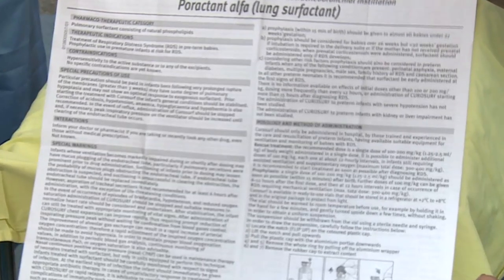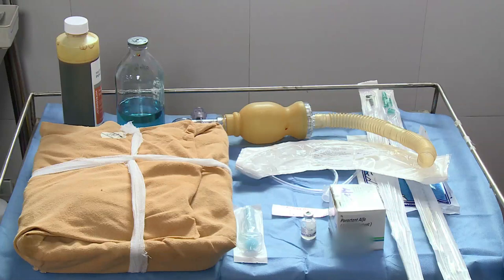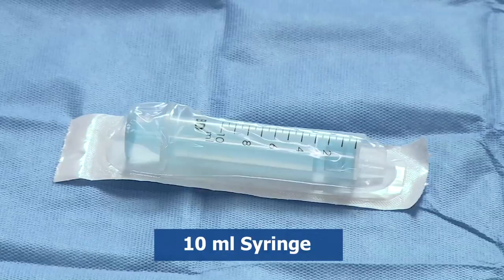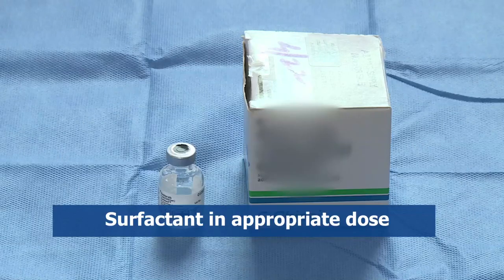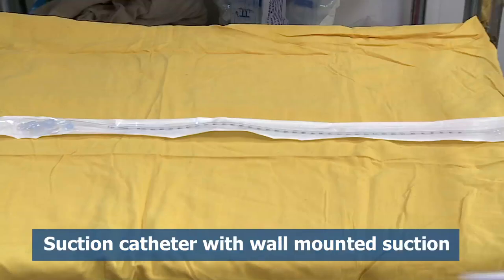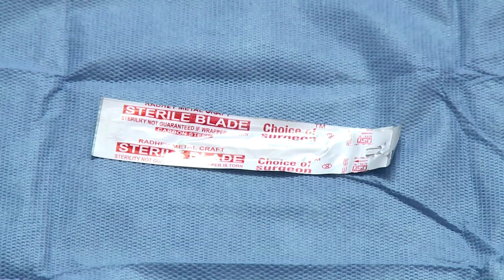Follow manufacturer's instructions carefully. For surfactant administration we will require: spirit and betadine, sterile gloves, a 10 ml syringe, surfactant in appropriate dose, bag and mask with oxygen supply, suction catheter with wall-mounted suction, orogastric tube, and sterile blade.